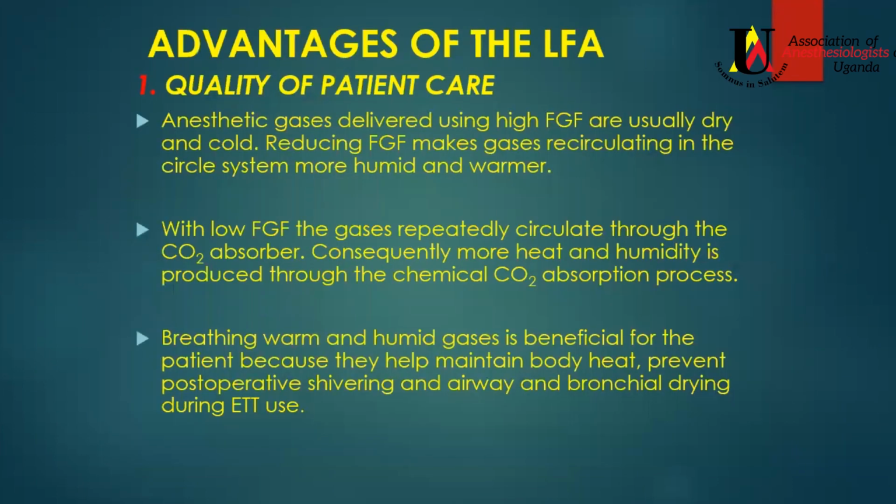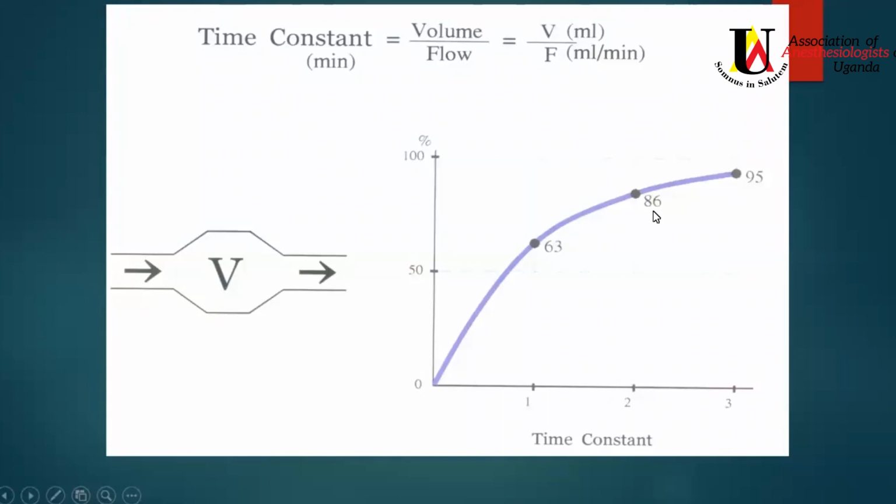Now, to go back to this, remember that this does not only act on deepening, but also when you are reversing your patient. If you are switching off your gas, remember, if this is almost a closed system, the patient is going to be rebreathing this same isoflurane, okay? Whatever they breathe out, the expired concentration is going to be the same after you've switched off. So they're going to keep resaturating this. So it's going to take a while for this to drop back to zero, unlike when you are using high flows where it's diluted and washed out. So deepening and also awakening.